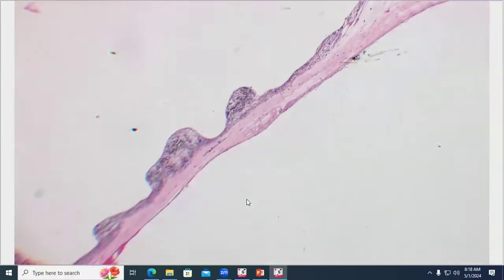Do we know anything about the timeline? Because it's impressively devoid of lens fiber, like everything has been completely resorbed. They don't give us a listed duration. We didn't see any lens fibers. There was hemorrhage inside the lens capsule. Wow. As you might expect. So presumably the lens fibers were resorbed and we don't have a duration listed. And we haven't gotten any information about a potential porcupine event and when that may have happened.